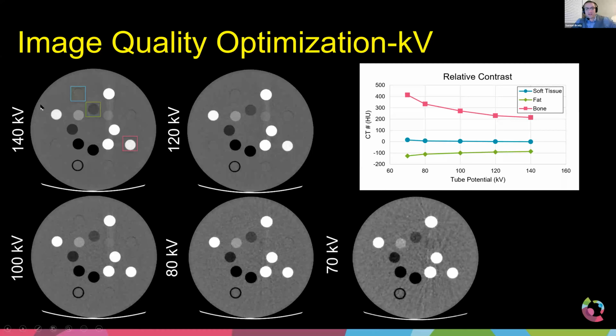All right. So how does kV change the quality of the image? In this, I had a very basic water-based phantom, and it has these sensitometry rods in it. Each one of these little inserts basically mimics a different tissue in our body. Obviously, you've got bony anatomy, maybe contrast-infused vascularity, some lungs, air, soft tissue, maybe muscle. So it's all meant to be a way to see if the system can calculate the correct CT number for all of our various different tissue types.